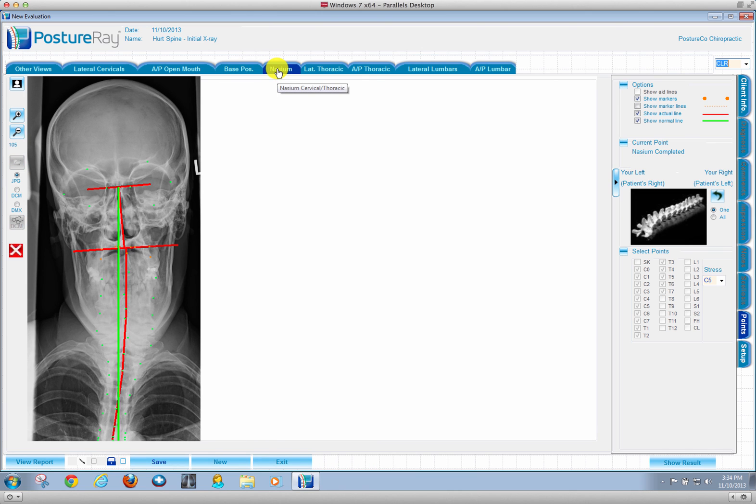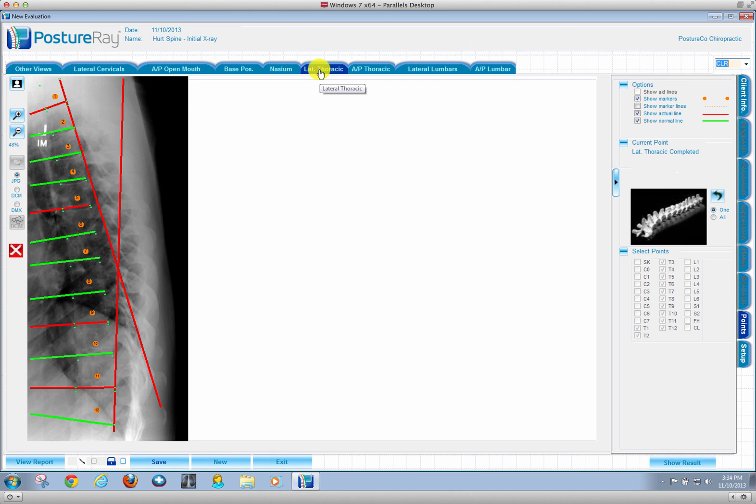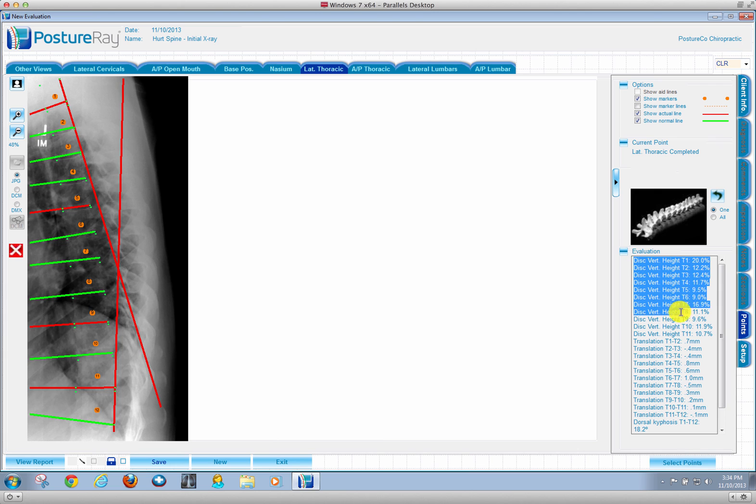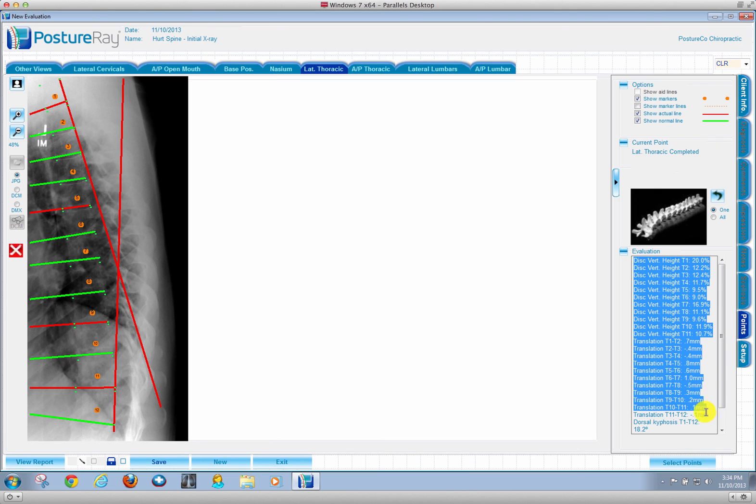Nasium analysis, lateral thoracic, and we're measuring everything that Clear technique does. We have all the disc height percentages, translational distances.